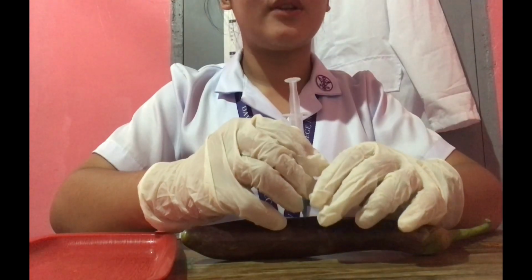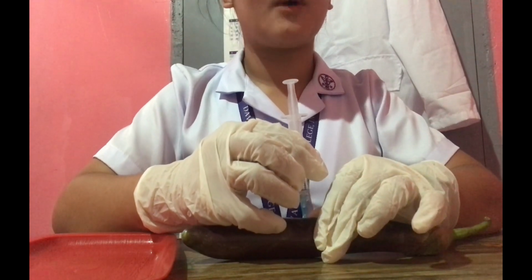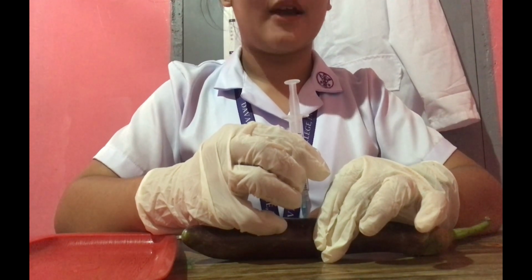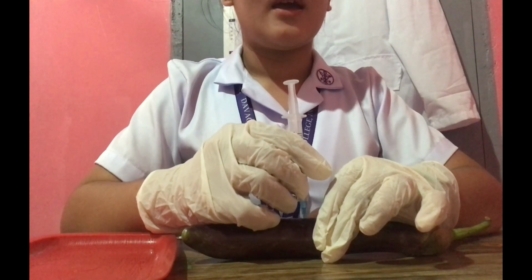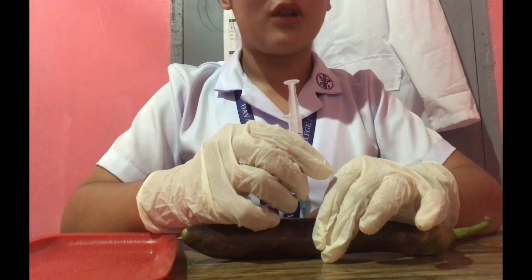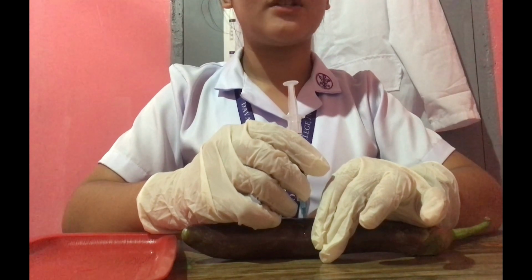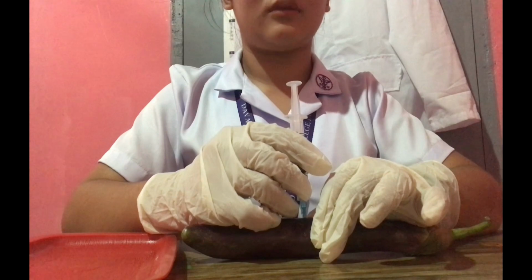Use the ulnar side of the non-dominant hand to pull the skin approximately up to 2.5 centimeters to the side. Under some circumstances, such as for an emaciated client or an infant, the muscle may be pinched. Holding the syringe between the thumb and the forefinger, then pierce the skin quickly and smoothly at a 90-degree angle.